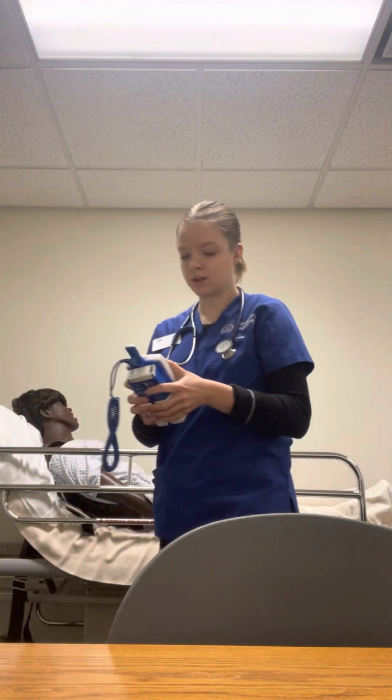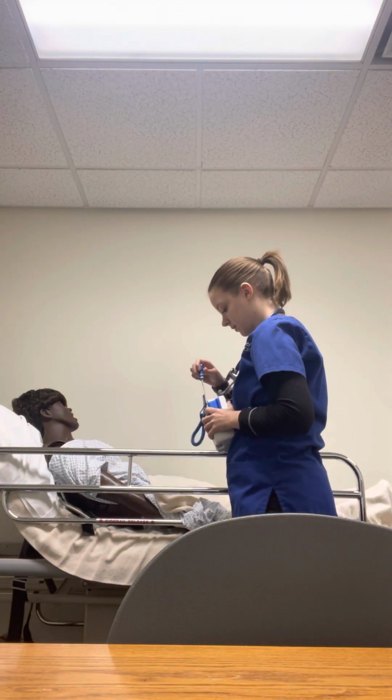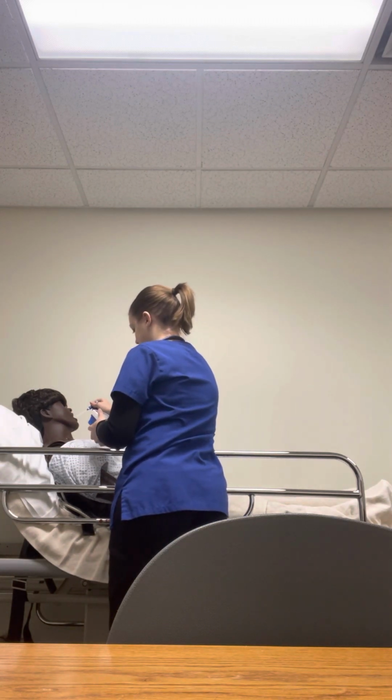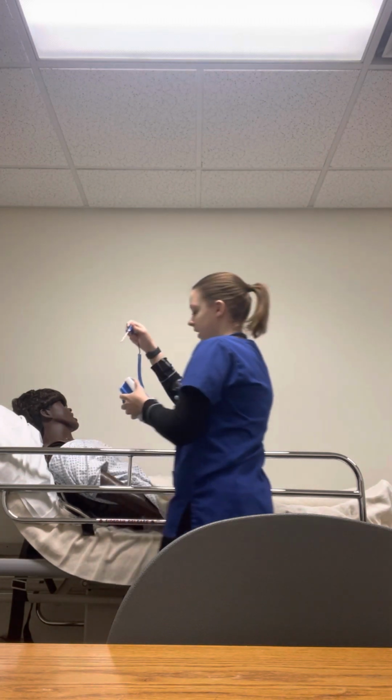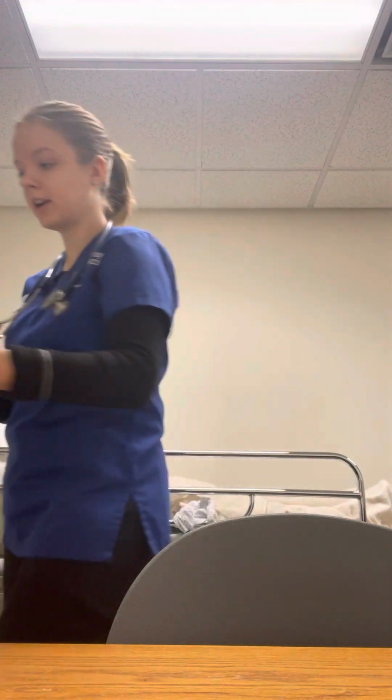Next, I would get a temperature. For moms, we do an oral temperature. Under your tongue, please. Her temperature says that it is 95.0 degrees Fahrenheit, and this is the end of my vital signs.